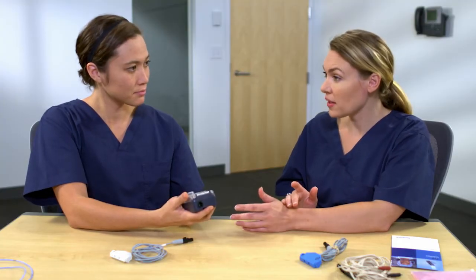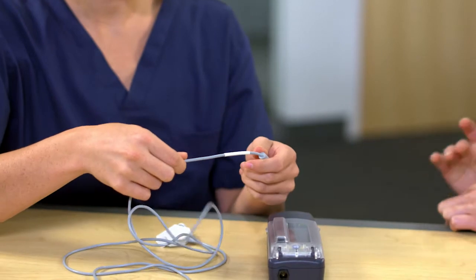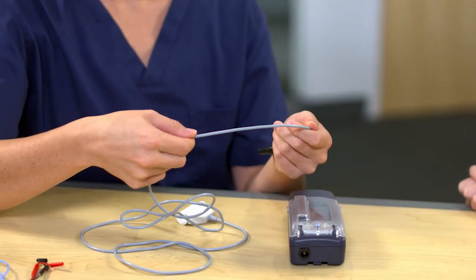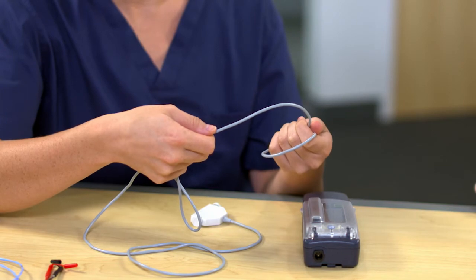You'll also want to make sure there are no cracks in the case or other defects. After that, you'll need to check the cables. Visually inspect the cables before using to ensure there's no deterioration, brittleness, cracking, thinning, or bare spots. Checking the cables for signs of wear before each use will continue being a priority for us.